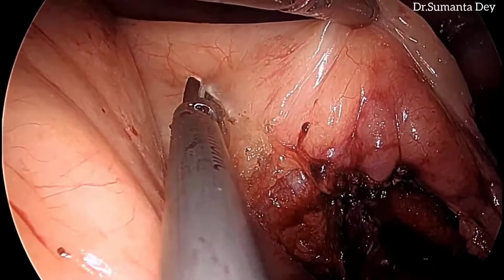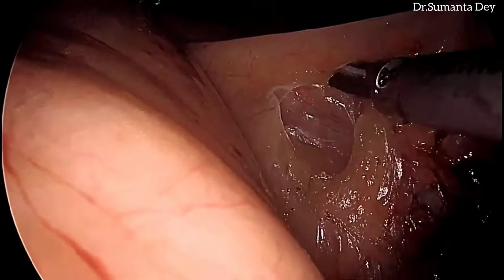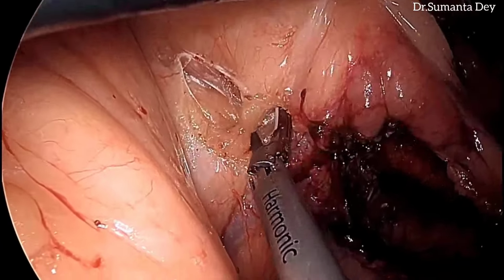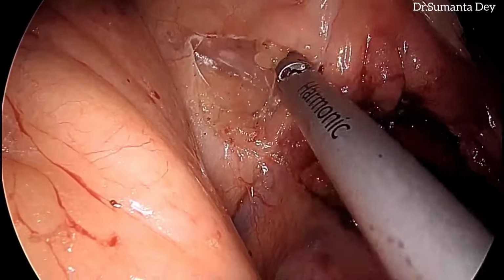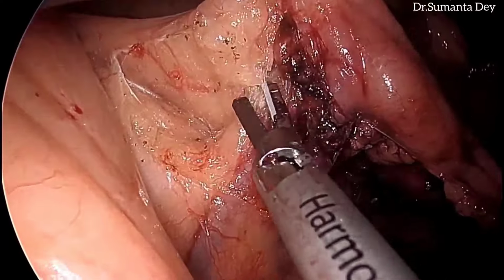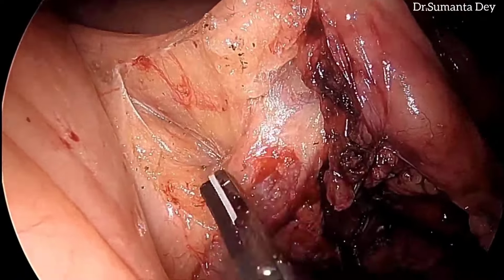After this medial to lateral dissection, above the inferior mesenteric vein, I am giving a peritoneal incision and trying to identify the plane between the anterior surface of the pancreas and the mesocolon. So this is the IMV, you can see.